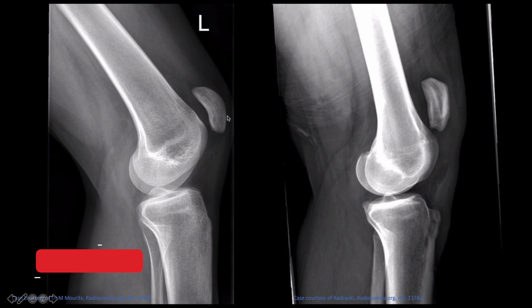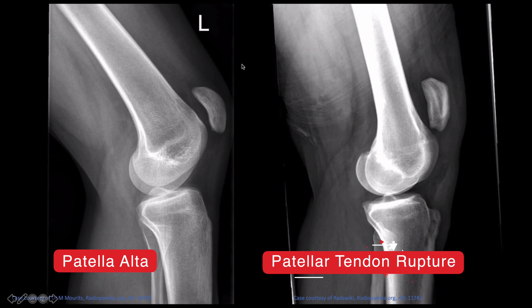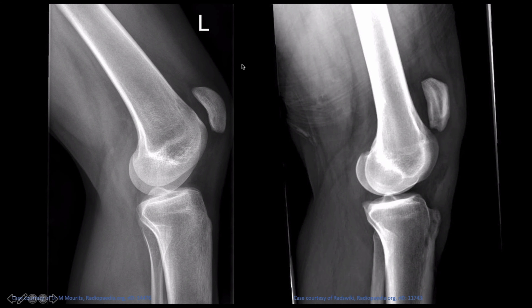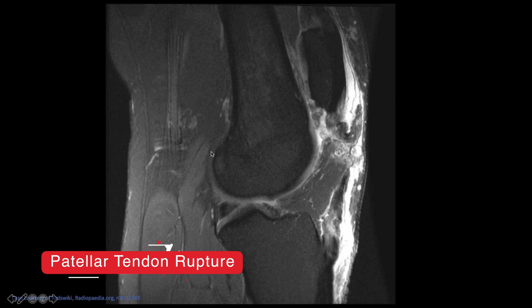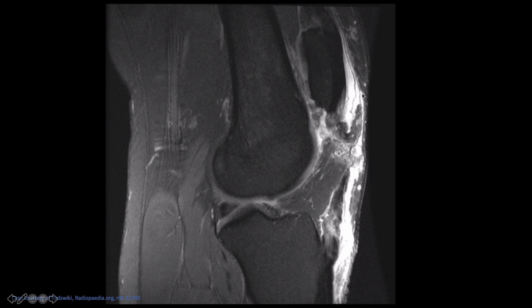These are two cases - one for patella alta on the left, and the other is patella tendon rupture. It can be difficult to differentiate between the two, but in this case there's soft tissue swelling in front of the patella suggesting traumatic origin, and some irregularity where the patella tendon should be. Comparing Hoffa's fat pad there's a little more fluid than expected. On MRI, you can see significant soft tissue swelling, disruption of the fibres of the patella tendon, and fluid all around the area.